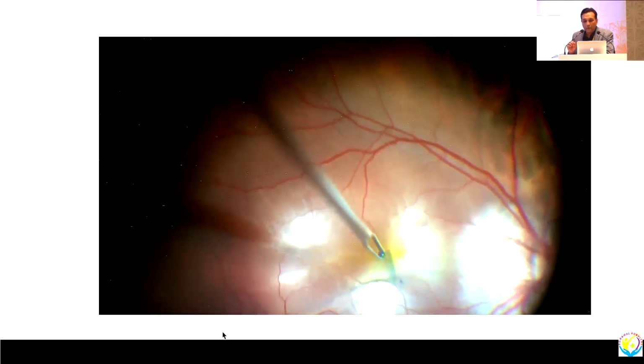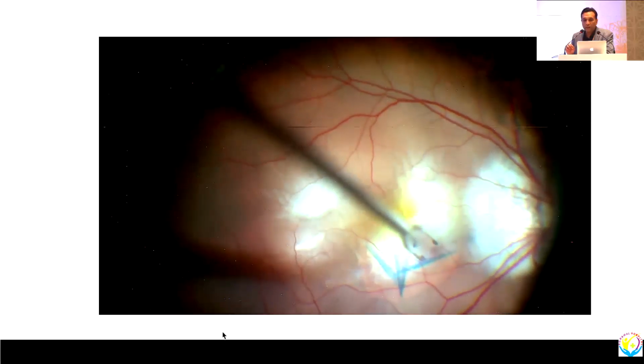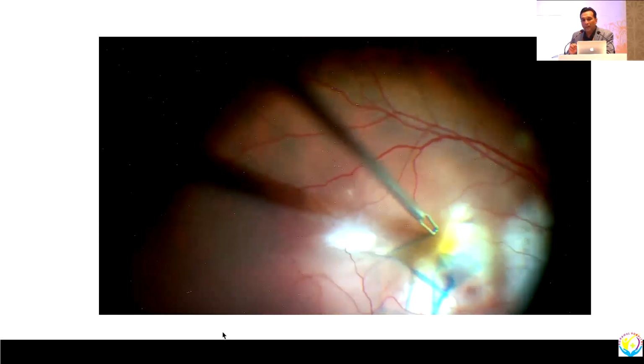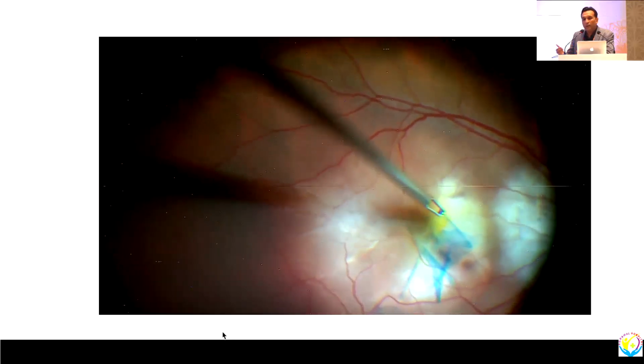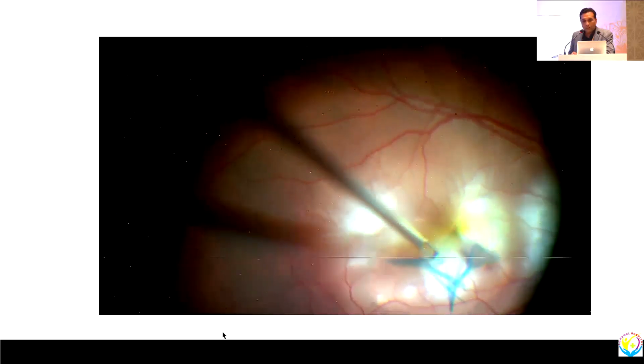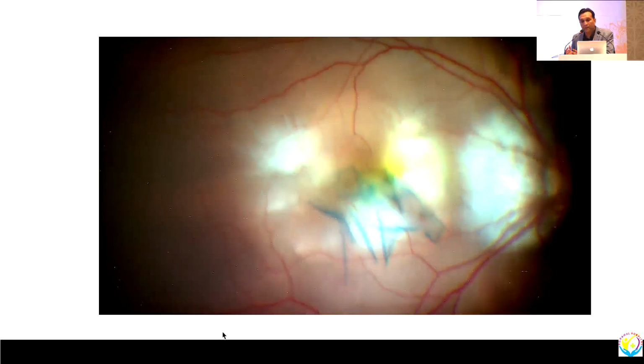Now, if you start peeling under a detached retina, the first pinch and peel will be a little tricky, but once you get the flap, it is actually very simple, and you can make multiple flaps like I am making, and you can direct them towards the hole to make it an inverted flap technique. Only the first pinch is a little tricky. Now I have all those flaps in the center. Now is the time when I do the base dissection and all the maneuvers. And in the last, I inject the PFCL to keep that flap in place.